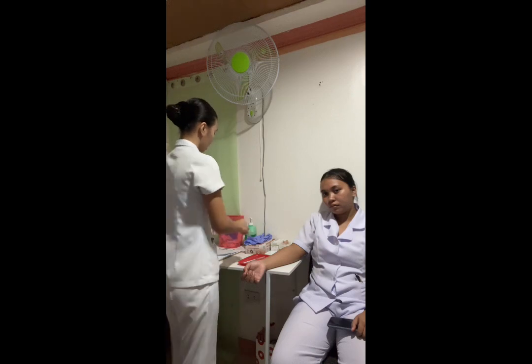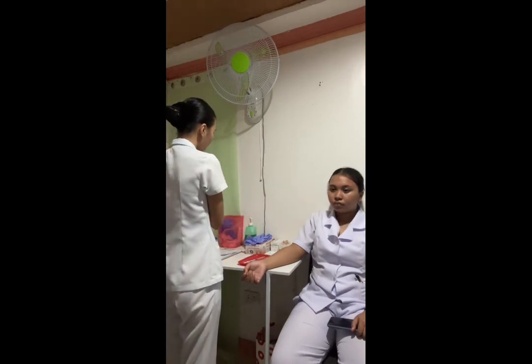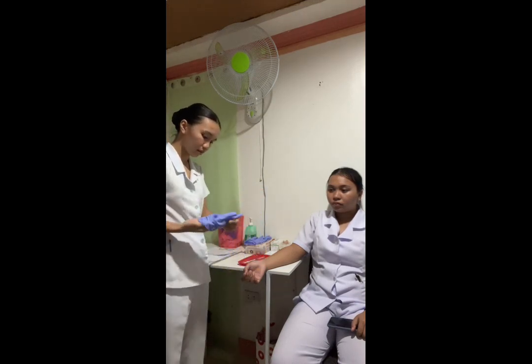And then after that, we apply gloves as indicated by agency policy. We have to cleanse the skin at the site using a firm circular motion, starting at the center and widening the circle outward, and also allow the area to dry thoroughly, because cleansing the injection site prepares it for the injection, and this method will also remove pathogens away from the injection site. Okay, since I have performed hand washing earlier prior to coming here, I can now wear my gloves.